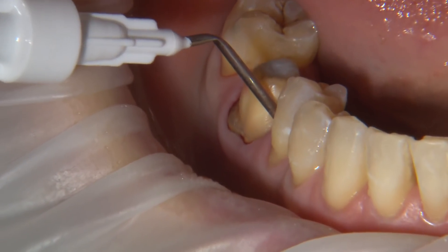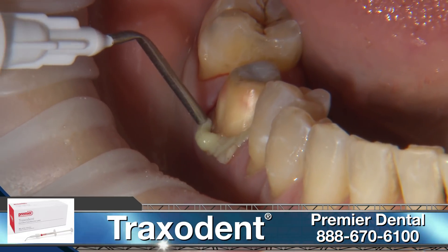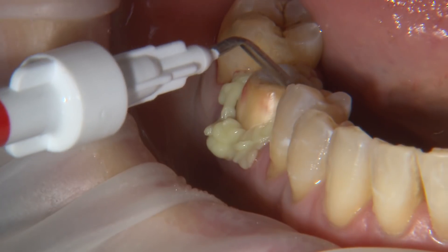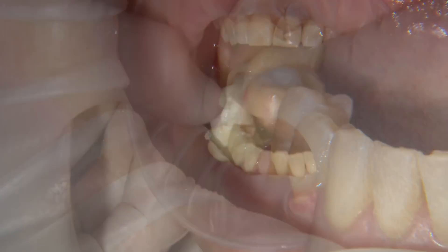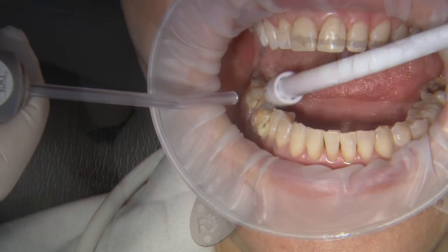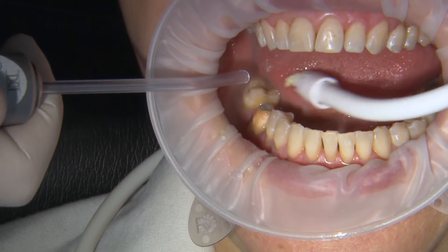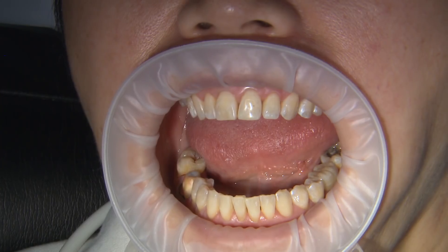The next technique involves a retraction paste application. A brand such as Traxodent works well and has built-in hemostatic qualities. The paste is applied around the margin and injected into the sulcus as much as possible. A compression cap is placed over the paste and the patient is told to bite together with pressure for two minutes only. The most important part of paste retraction is the complete removal of all remaining paste before starting the scan process.